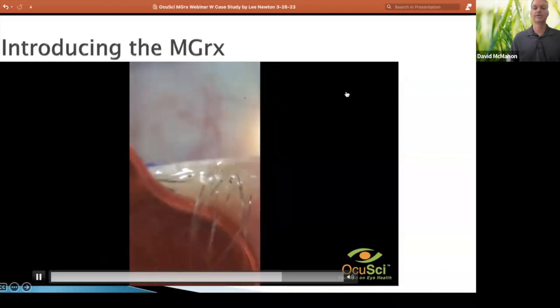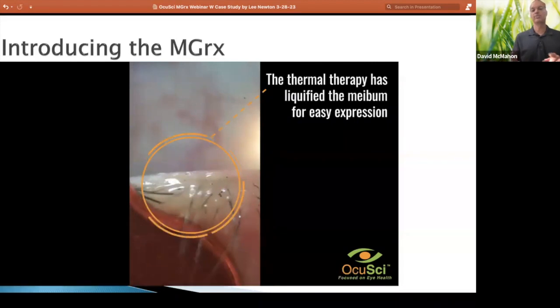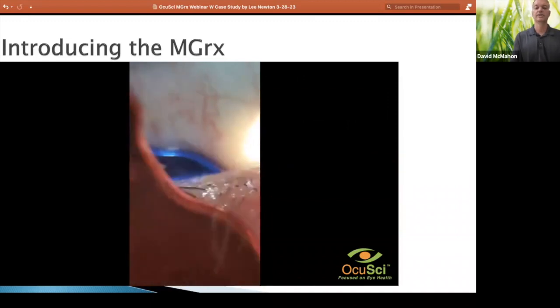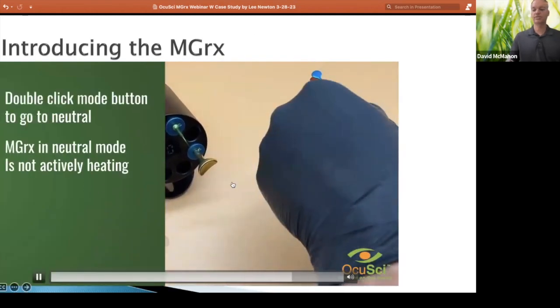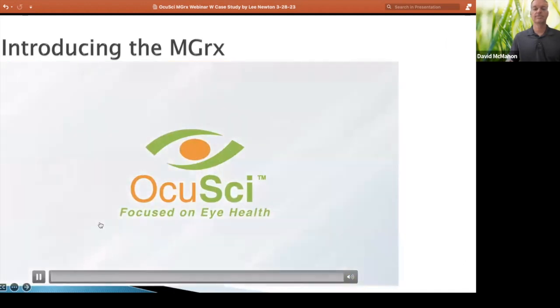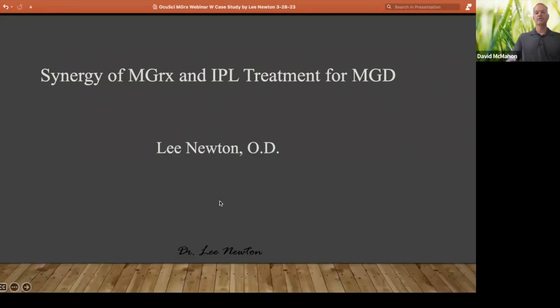Here you're going to see some pretty good expression because we've debrided, we've massaged, and again we're keeping heat on that. That is pretty much it in terms of the three steps. Not a whole lot of in-servicing or new learning required to use the MGRX.